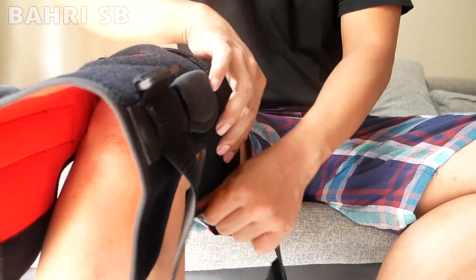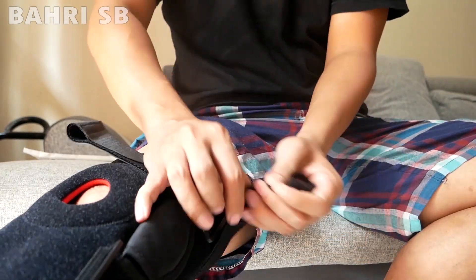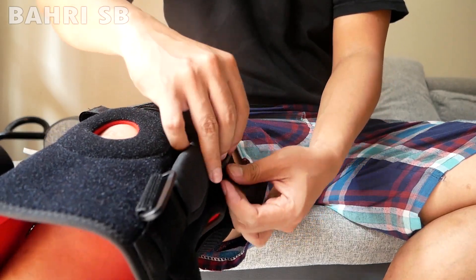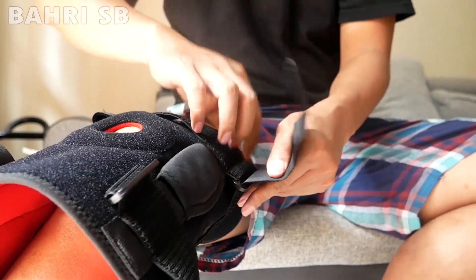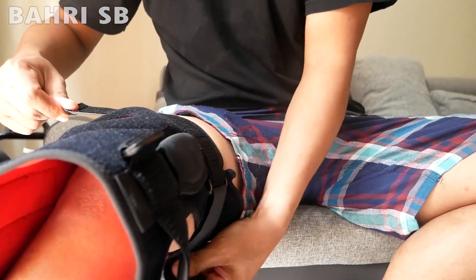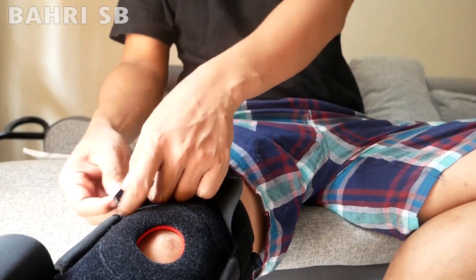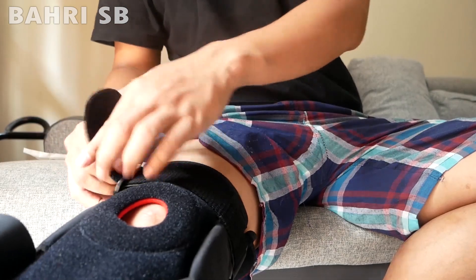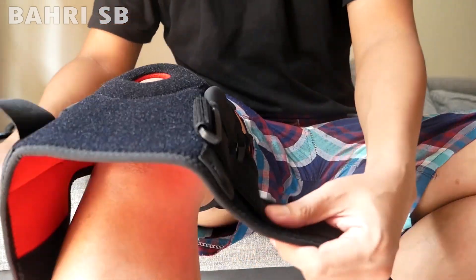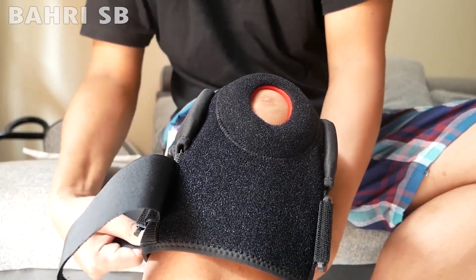Cara pemasangan seperti ini: jangan lupa bagian atas dan bawahnya jangan sampai tertukar. Pertama rekatkan klip bawahnya, lalu masukkan strapnya — strap yang ada di bawah, setelah itu strap yang ada di atas. Jadi ini ada 4 strap, lalu yang pada bagian bawah juga strapnya dikencangkan.